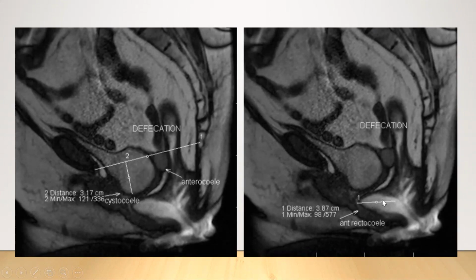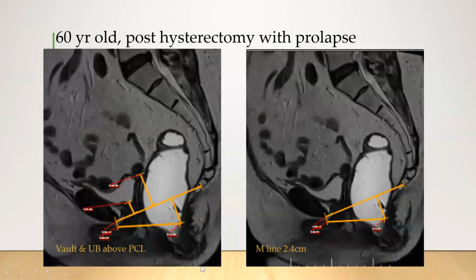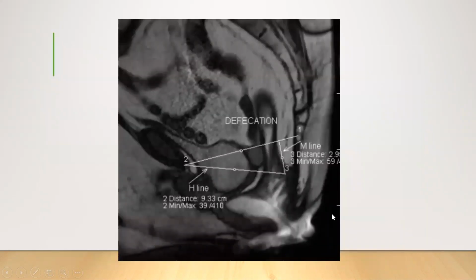And on the last image, we can see that in the late phases of defecation, you can identify again an anterior rectocele, which is coming over here. To make it understood again, this is the anal canal wall itself, so the anterior margin of the anal canal will be taken as a landmark. If you see the rectum going in front of it, that would qualify for an anterior rectocele. So the same patient has descent of the pelvic floor in the posterior compartment at rest itself, and on defecation shows a cystocele and an enterocele along with an anterior rectocele.